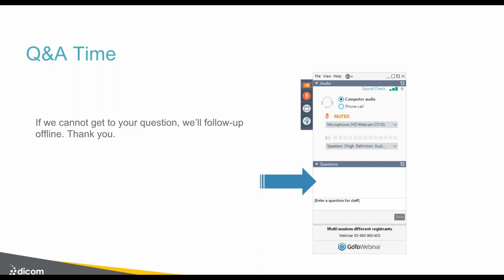But in the meantime, for us to make this a non-manual process, meaning an automated process as much as possible for you, Bob, we would need to understand how reliable is the data source to always have the PHI in the same coordinates. If it's unreliable, then exclude it from the data set, because you're going to almost certainly introduce some kind of a HIPAA violation. I hope that answers the question, Bob.